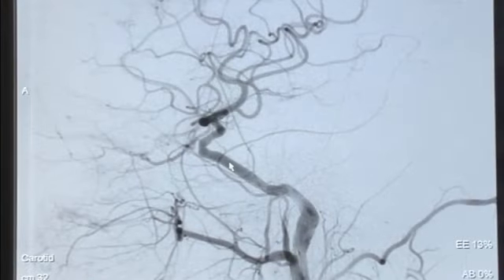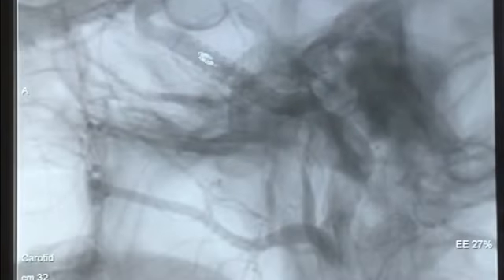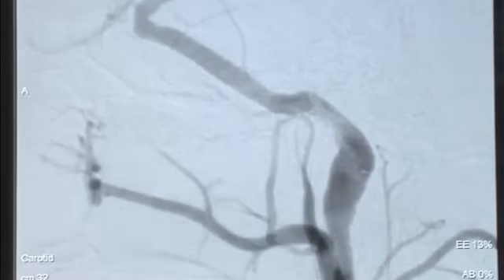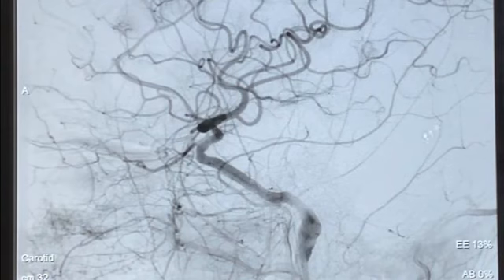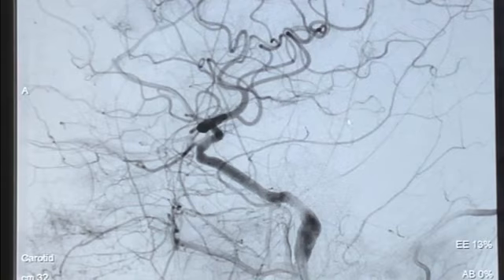And we have to take a common carotid injection to see whether sometimes your external carotid might show better. So we have a beautiful length of carotid, and the grafts are sitting there nicely. We can see there that's a graft, and the fistula site is closed, and there is no carotid-cavernous fistula filling whatsoever from the external or internal carotid artery. The angiogram shows a beautiful cure of this disease, the carotid-cavernous fistula, which is a traumatic type A carotid-cavernous fistula, which is now cured.